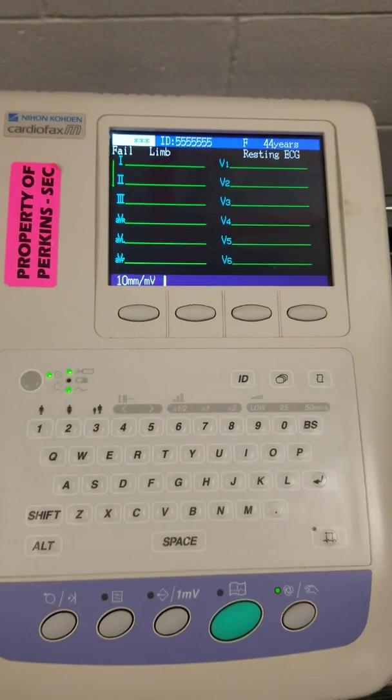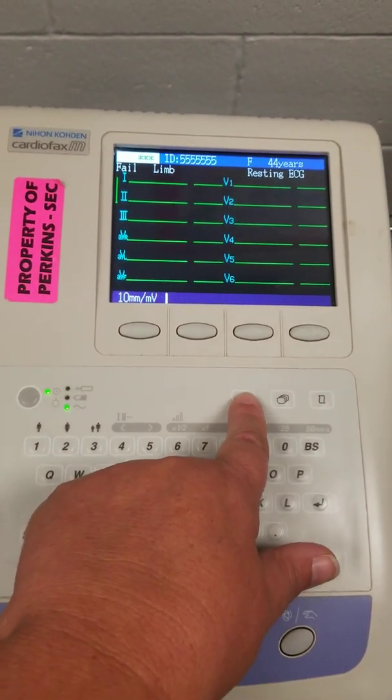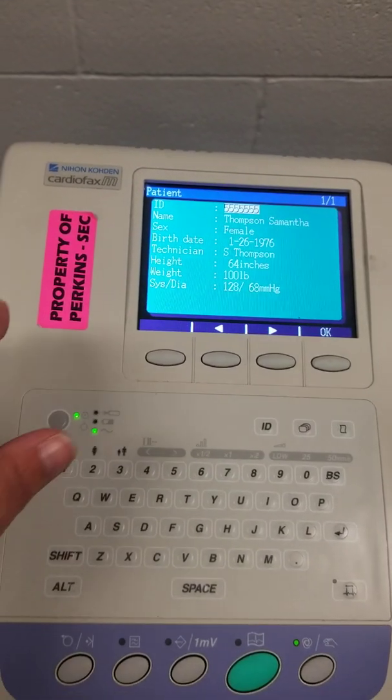Before I can do any EKG, I have to put in my patient's information. To do that, I'm going to click the ID button. I've already inputted my information using myself as the patient.